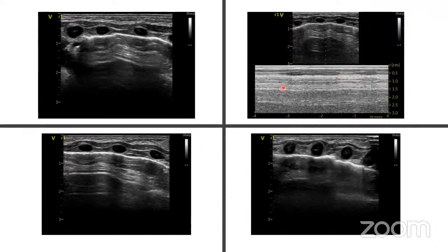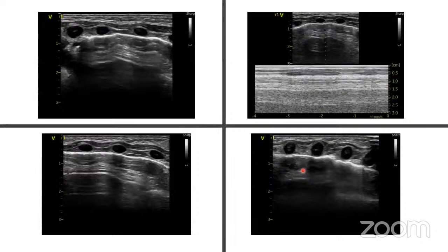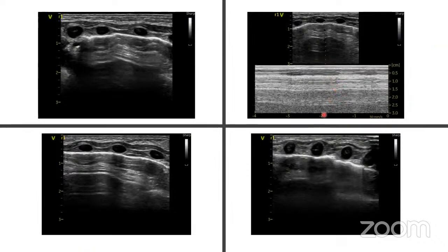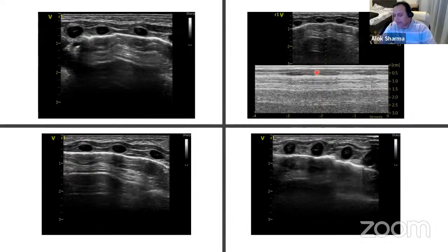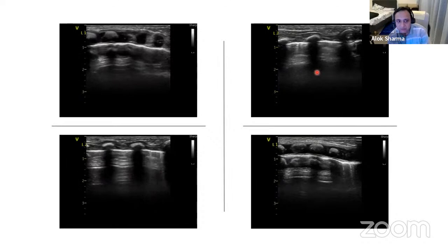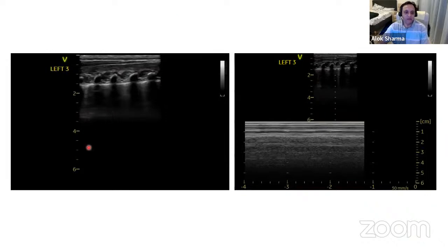My gut feeling is that next time maybe I should put them side by side, but I'm just comparing them. Do you see a lung point in the middle? My gut feeling is it's over here. So this is basically a barcode that you see coming through, and this is the seashore sign. So that's the barcode, and this is the seashore. Excellent. So what I'm trying to say to you is it can be very subtle. And in this baby, what we think is the real problem is actually transient tachypnea of the newborn. The baby's just having delayed clearance of lung fluid. But it's really important from your perspective. Again, this is the L3 region. I'm just going to play it again so that you can actually see it better.